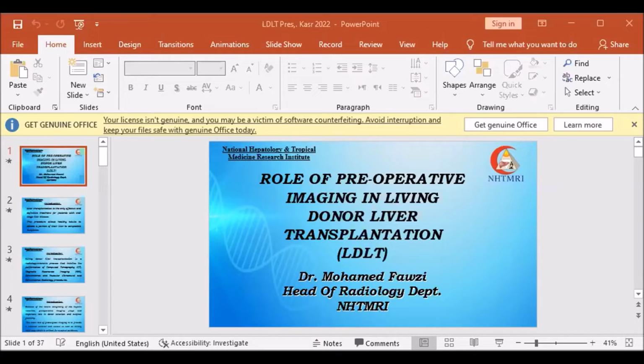In the portal dominant phase, during the triphasic procedure, you have to clearly identify the portal vein by itself without any other opacification of any vessels, so that you can take a good image. As you can clearly see here, you have a pure portal phase in the procedure. Then we do a hepatic portography, a 3D image, in order to clearly identify the anatomy of the portal vein, which is very well opacified in the coronal and axial images. And then we assess the portal variants, whether there are any or not.